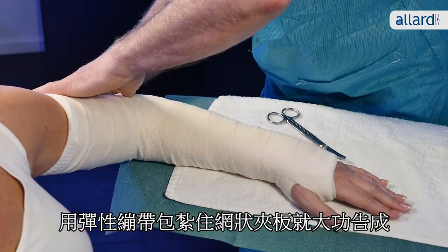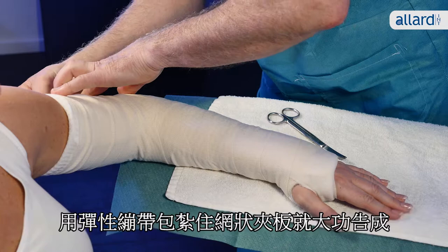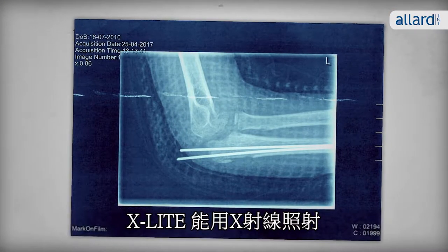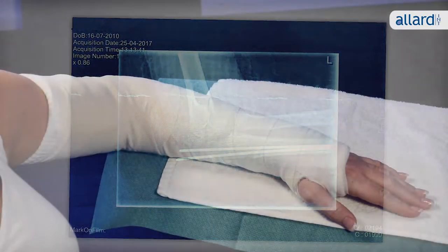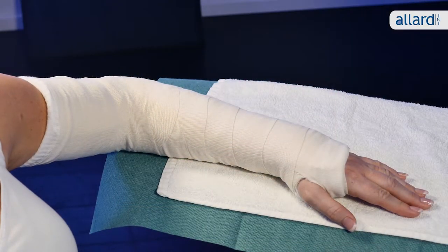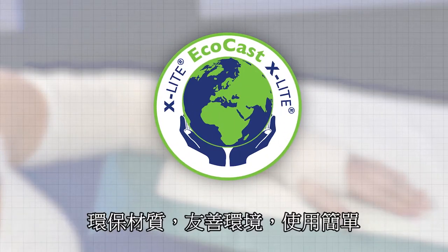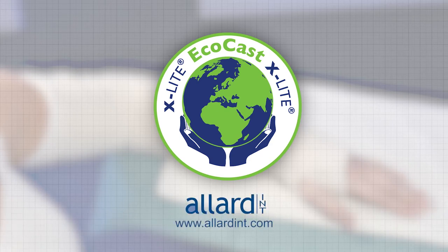Finish your work by securing the splint with an elastic bandage. X-Lite is of course X-Ray translucent. EcoCast — environmentally friendly and easy to use. For more information, please visit allardint.com.